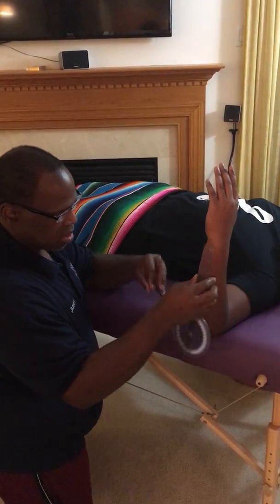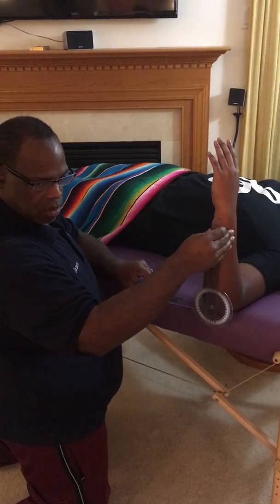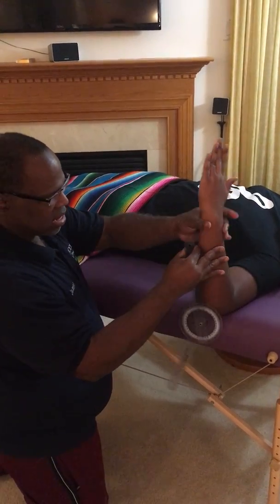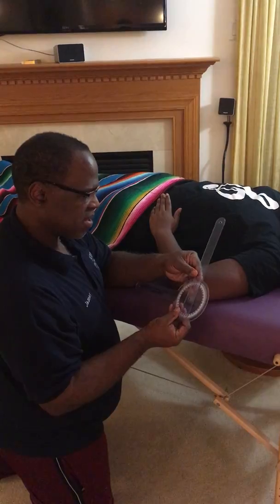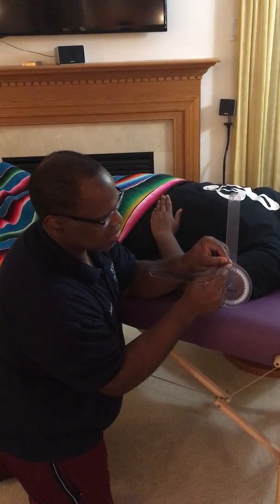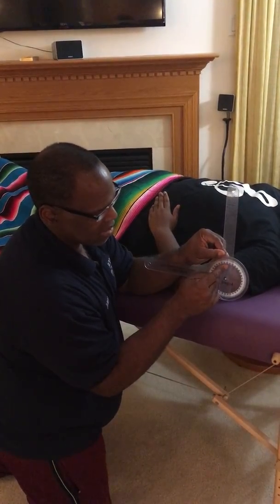So when we start for neutral, or the starting position, the goniometer will start at a 90-degree angle. This will be the starting position. And then we will read the goniometer. We will read the goniometer from the 0 point. Now, in this case, the 0 point is considered either the red 0 on the outside, if your goniometer has that, or it will be the 90-degree number that's here.